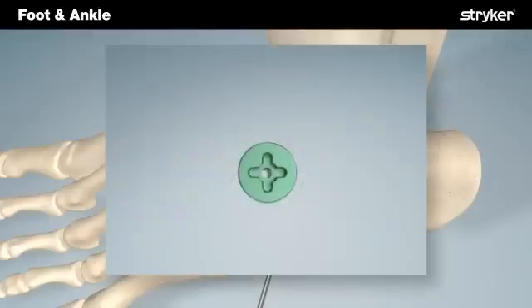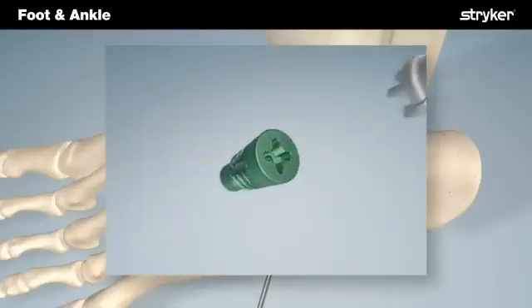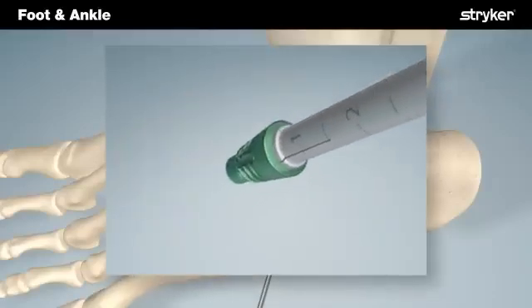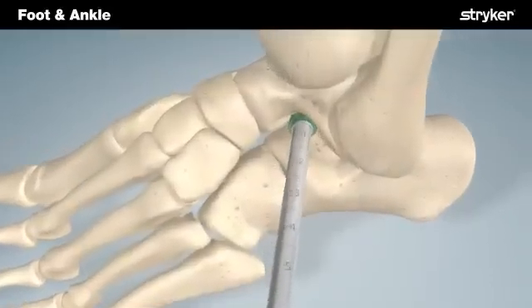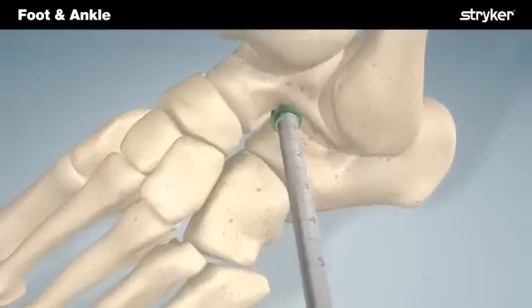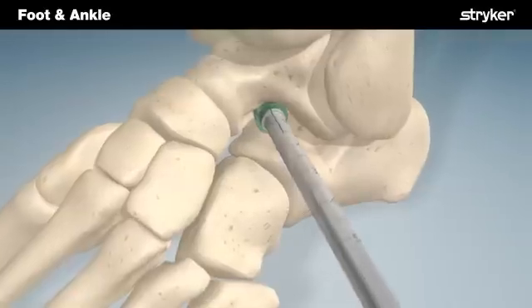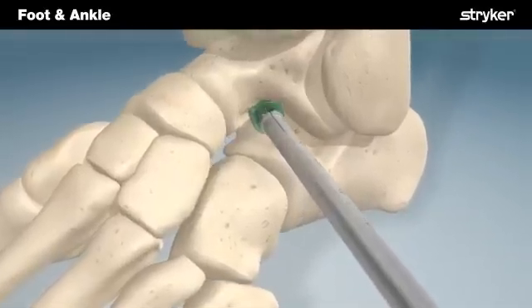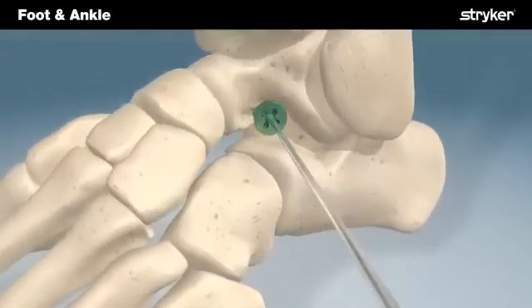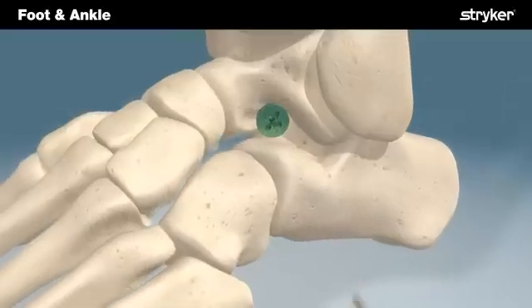Following trial implant removal, the appropriate implant is selected and attached to the driver handle. The driver handle is used to place the implant according to both the markings on the handle as well as radiographic verification. As with trial implant insertion, hindfoot motion and degree of deformity correction should be assessed clinically to verify adequate correction. The wound should be irrigated and closed in layers according to the surgeon's preference.